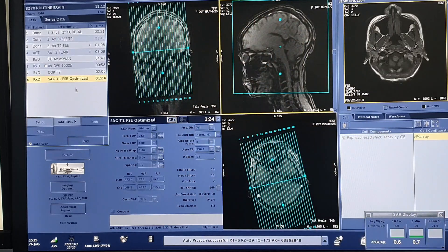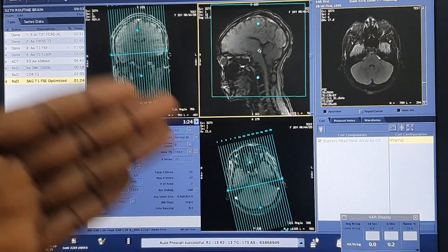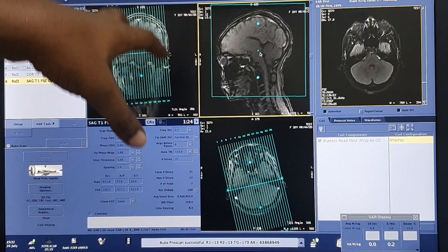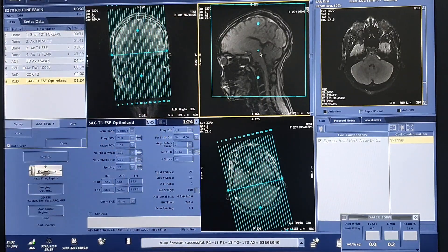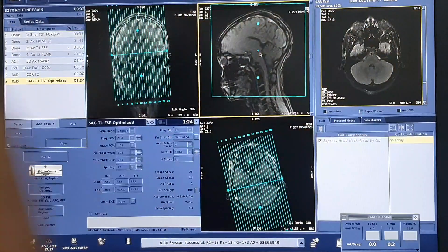So that is a quick summary of how you can plan for a routine brain MRI. All we have to do now is wait for the examination to complete and then we will go in and bring out the patient. I am actually playing a key string for her based on the song preference she chose. All this sound you are hearing right now is actually the sound coming from inside the machine. In order to reduce this particular sound, that is why we provide earplugs. And whenever a patient requests music to be played, you can play the preferred choice of music for them.